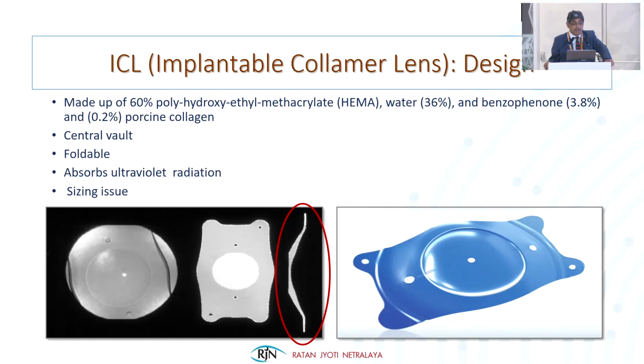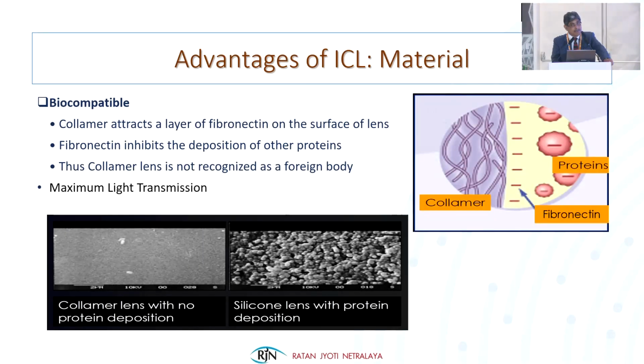And this is a foldable lens, and this vault accommodates the convexity of our crystalline lens. So this is a foldable lens and it absorbs UV radiation, but the important thing is the sizing.